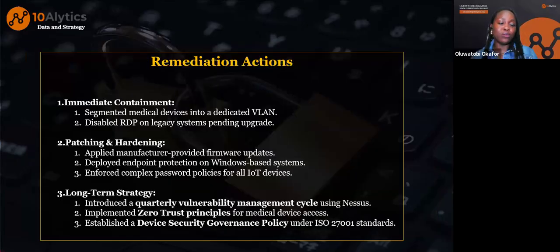Awesome. Now, based on what we have found, we can then go and tell Adria, okay, first and foremost, in the next 0 to 3 months, we want you all to divide your medical devices into special dedicated virtual local area networks, that is VLANs. The goal of this is to ensure that not anybody can just come in and take over the entire environment, right? If they come in through the door, you've locked the passageway so they can't reach any of the rooms. They are stuck in the sitting area, right?